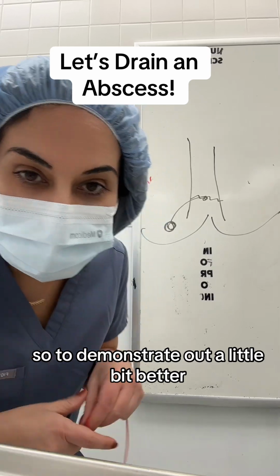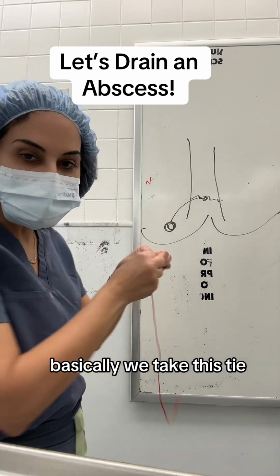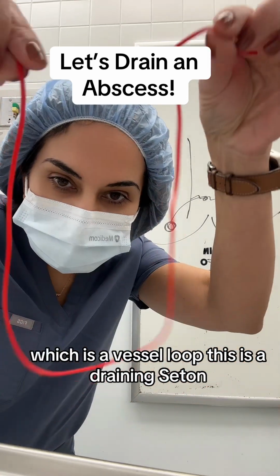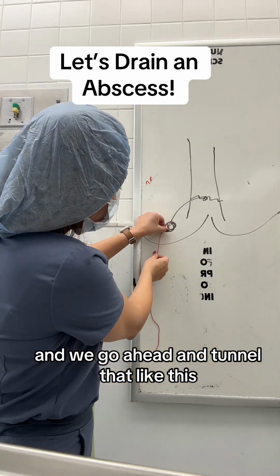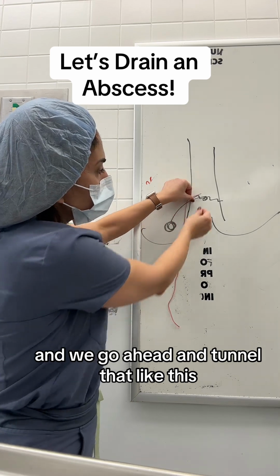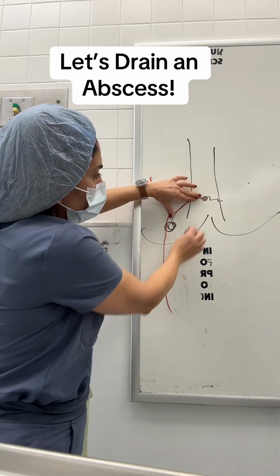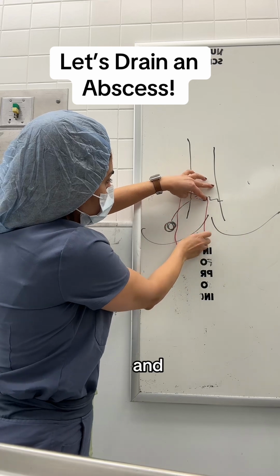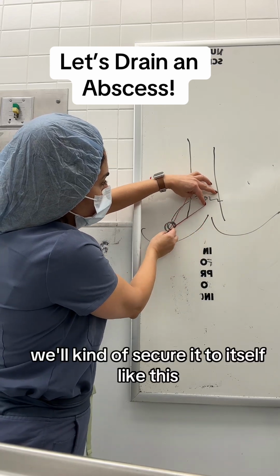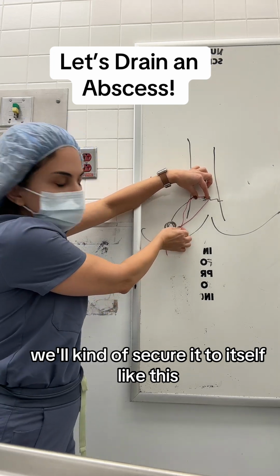Right, so to demonstrate a little bit better, I'm going to show you how it works. Basically, we take this tie, which is a vessel loop. This is a draining seton, and we tunnel that like this from the outside to the inside, right? And then we pull it through, and we'll secure it to itself like this.